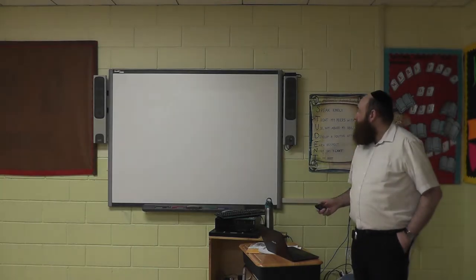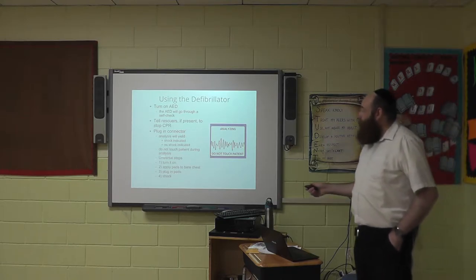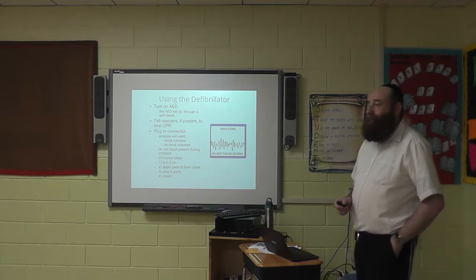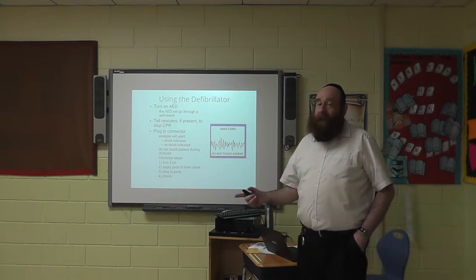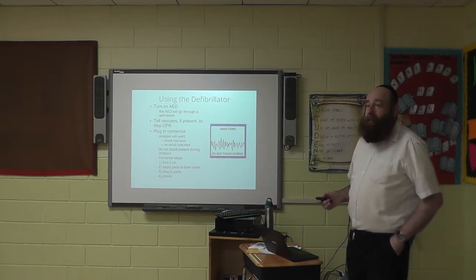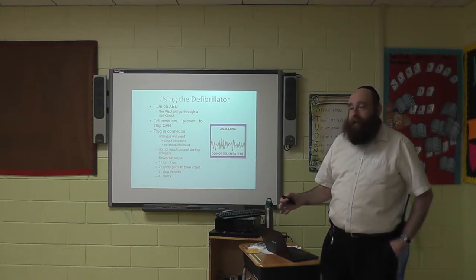All right, how do we use it? So I have four universal steps. I suggest you learn them. Step number one, switch it on. Oh, it won't work if it's off. Step number two, apply the pads to the patient's bare chest.